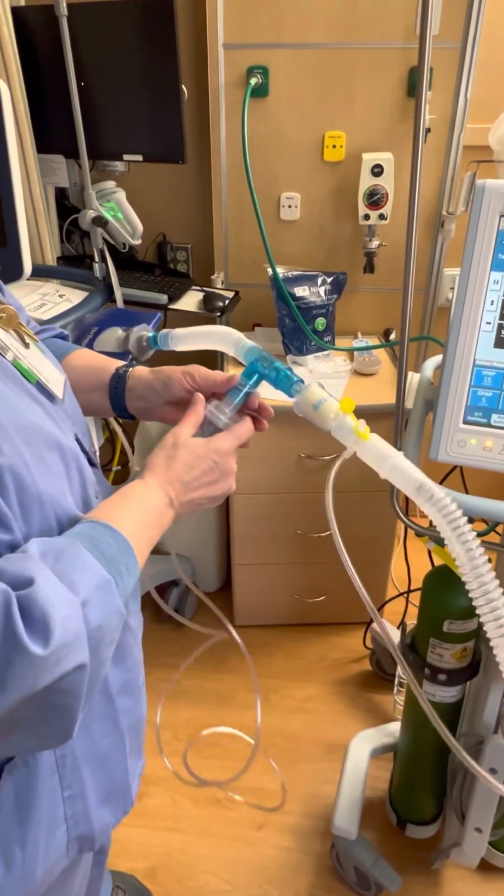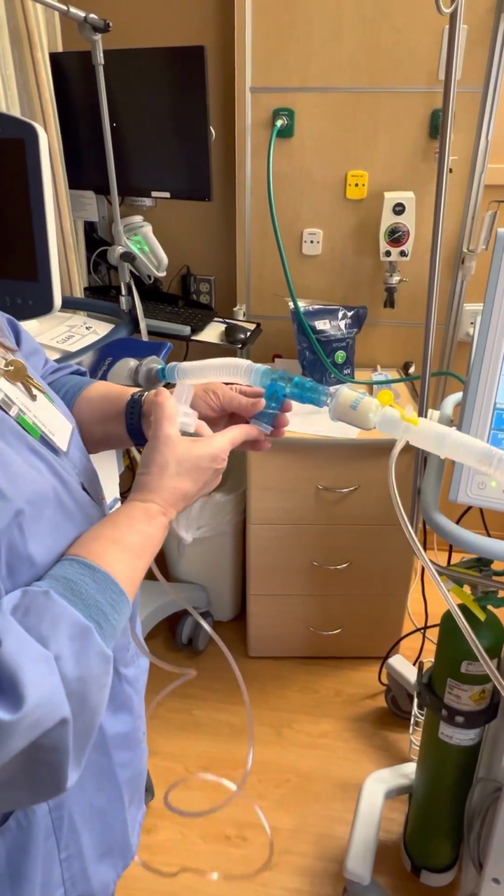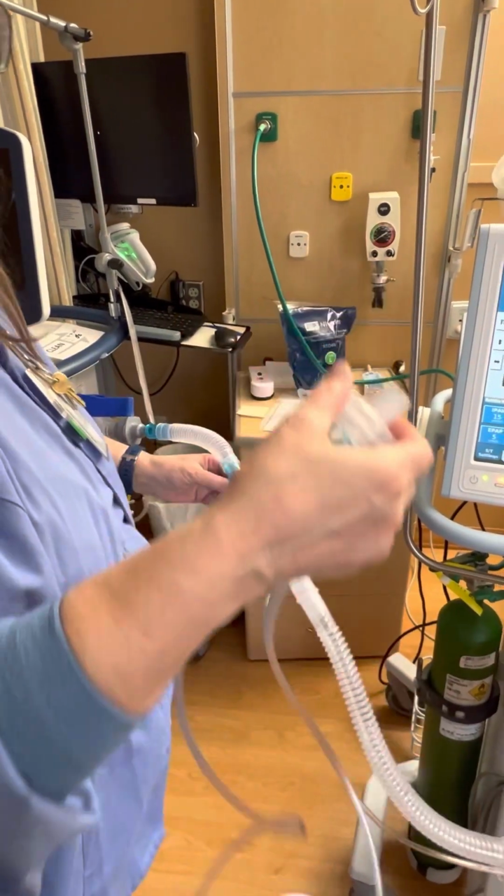When it's done, I do like to take this out, but make sure you cap it because you don't want something more heavy hanging on there if you don't need to.